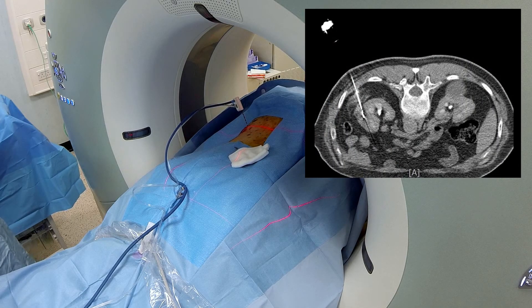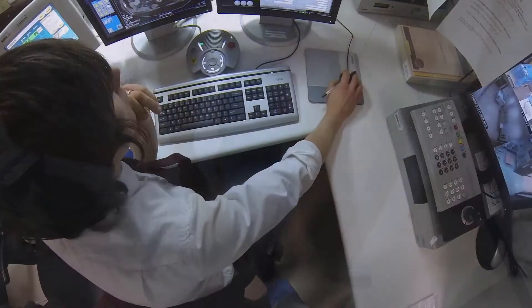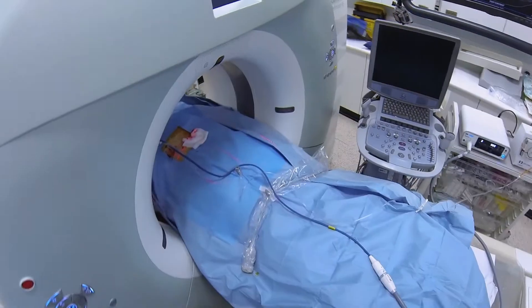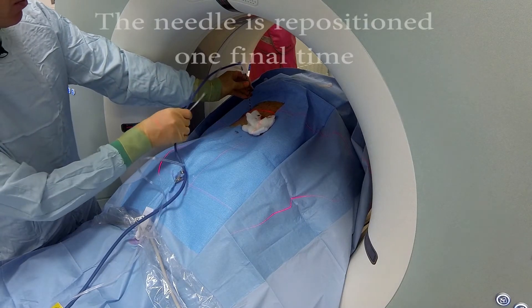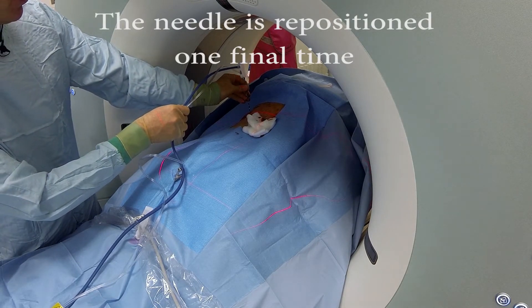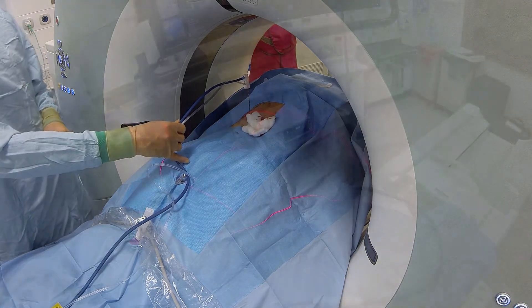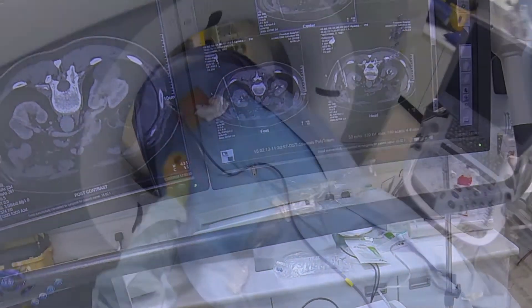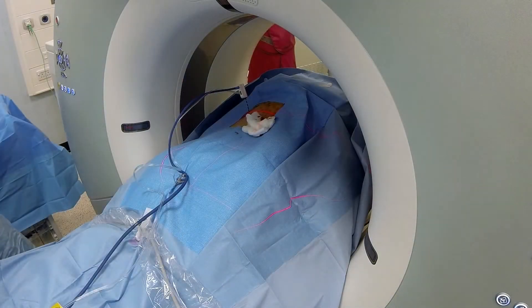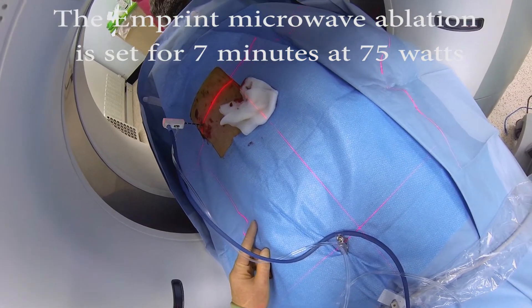So what we'll do now, we'll do a localised spiral scan and just check we're in exactly the right position before we start the ablation. Just breathe in for me, breathe out, and stop there. Breathe away. Straight through it there, I think. Just going to pull that back slightly. I think we can go for that — we'll go for seven minutes at 75. Okay, I think we're in position. We're just going to start the treatment.